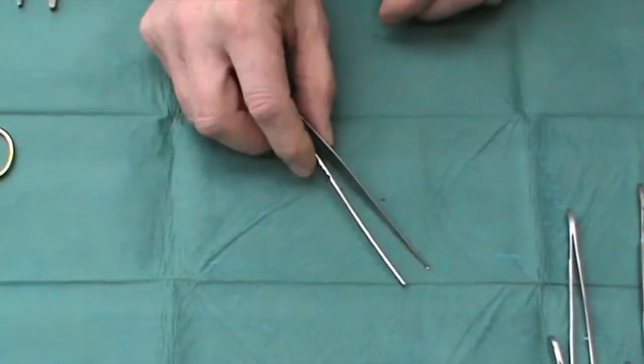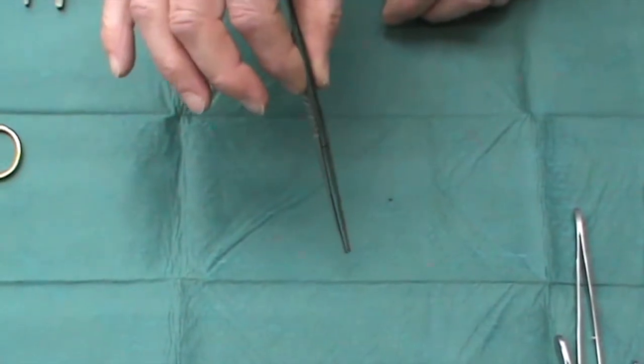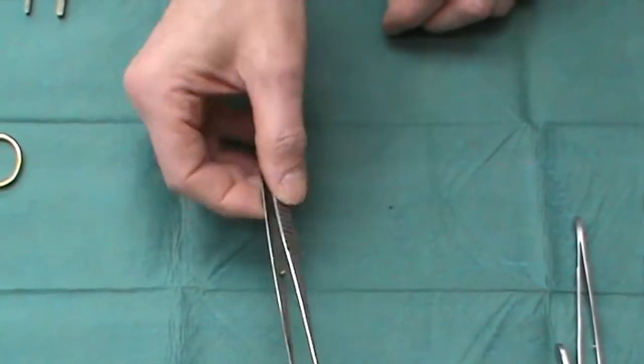These are often found in surgical sets — particularly useful for reaching into abdominal cavities — but if you're operating on skin, really they're too long and too cumbersome.